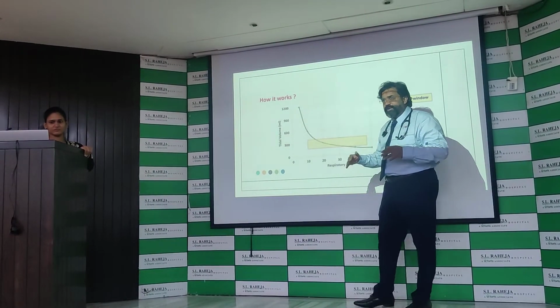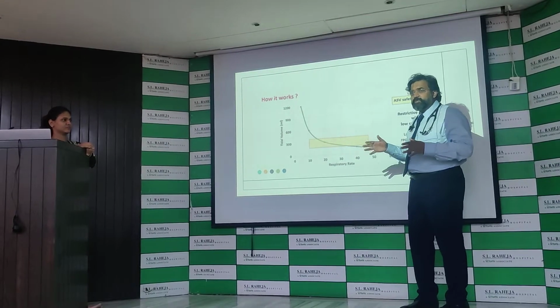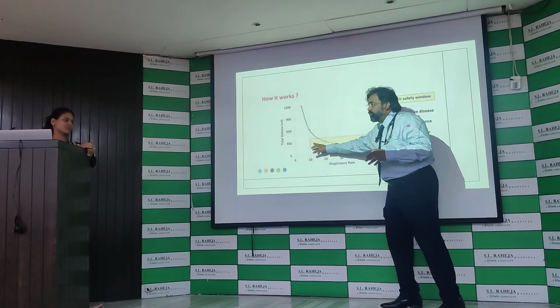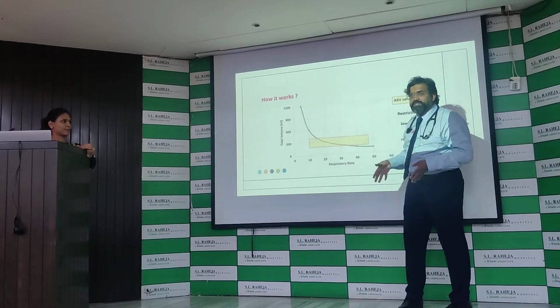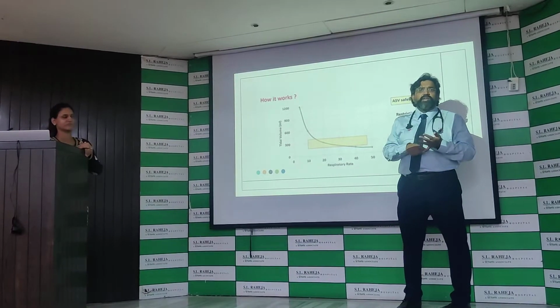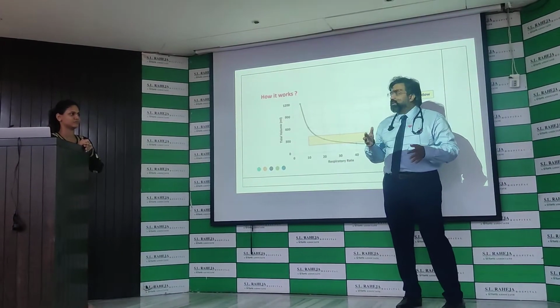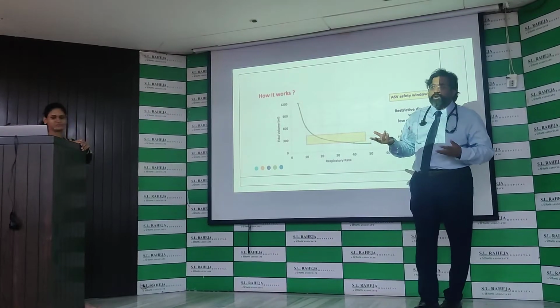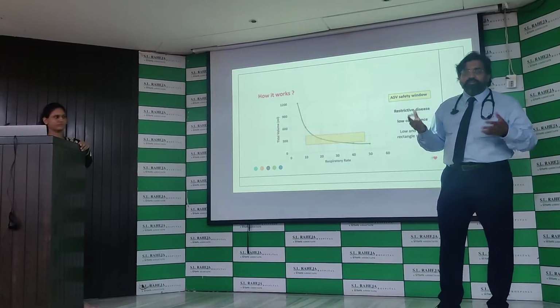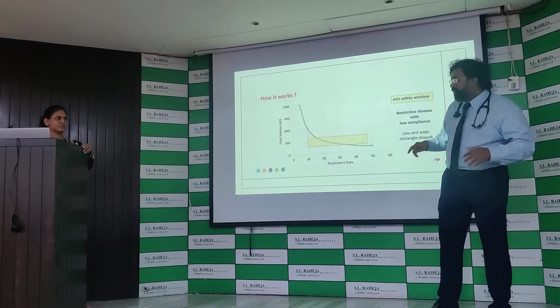Similarly, in a restrictive pattern, it is actually increasing the RR. So an ARDS patient will be in this window, and you don't decide that. The ventilator decides that, because the ventilator is calculating compliance. It will see the compliance is 10. Once it sees the compliance is 10 on a regular basis, it will start figuring out that this is probably ARDS, this is probably not okay. It will quickly come to this.